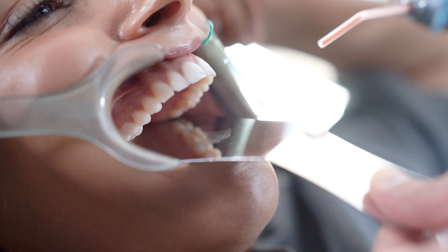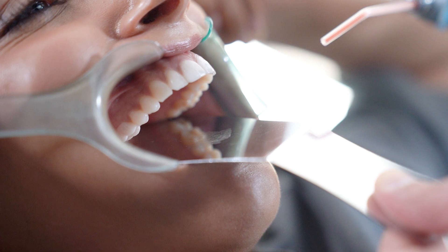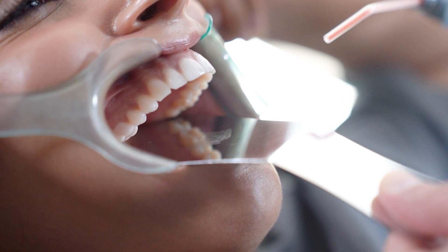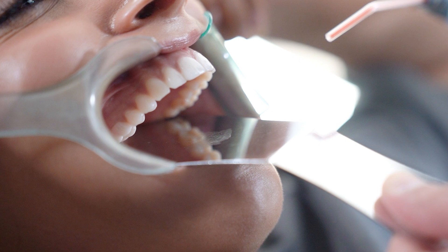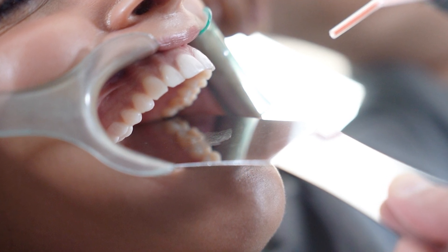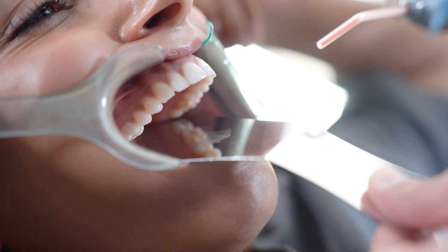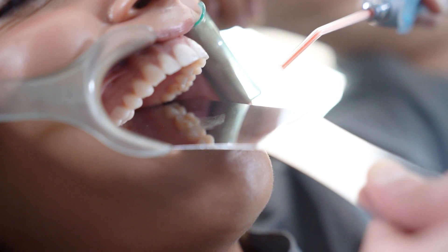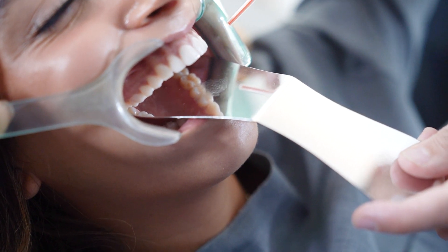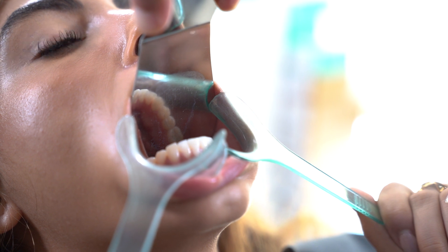The last two photographs are occlusal shots. For the upper occlusal shot, use the retractors and the mirror. Ask the patient to open as wide as possible. Insert the mirror and make sure that all incisors and at least the first molars are showing. To prevent the mirror from fogging, either warm the mirror beforehand or ask your nurse to blow air on the mirror using a three-way air syringe. Repeat the same for the lower occlusal shot.